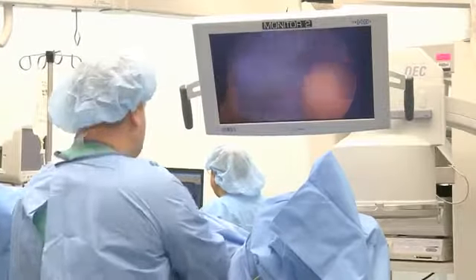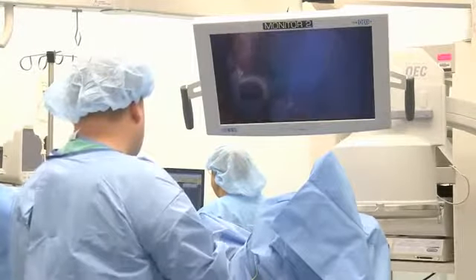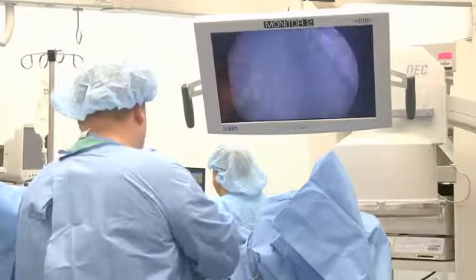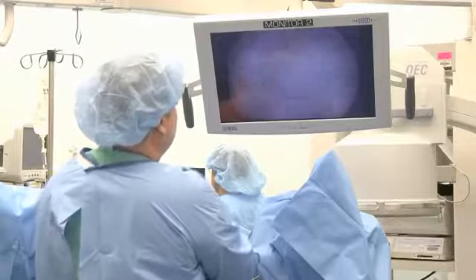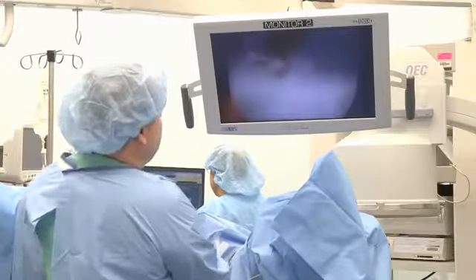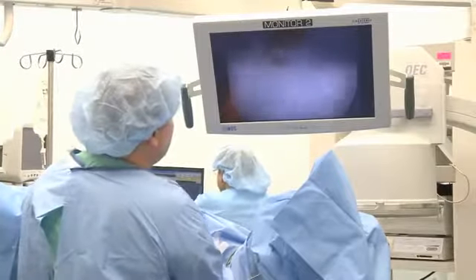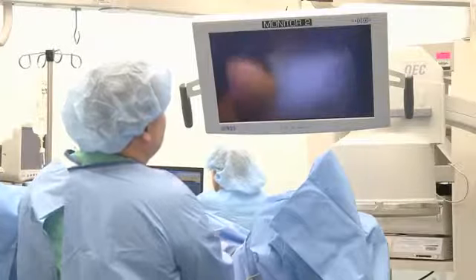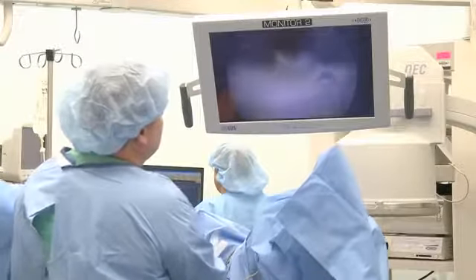Yeah, so we're getting a much better picture now with the high resolution, high definition monitors than we used to. Although we're somewhat hampered by our cameras, which are going to be updated soon. That's from our surgical vendor. We're going to get newer cameras that'll give us an even better picture. But the picture is a nice big image we can see, and you don't have to strain to see a little small monitor. It's much better for us ergonomically to work with.